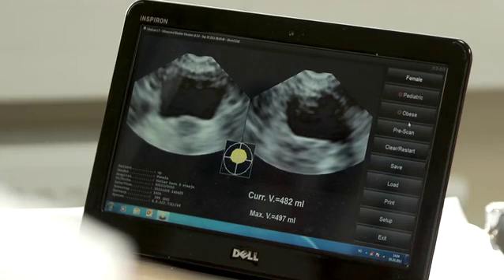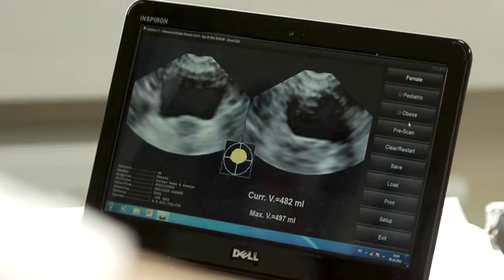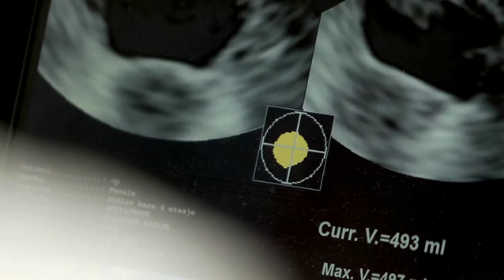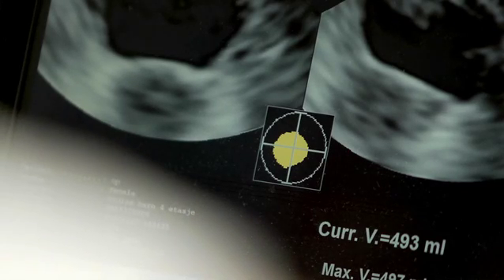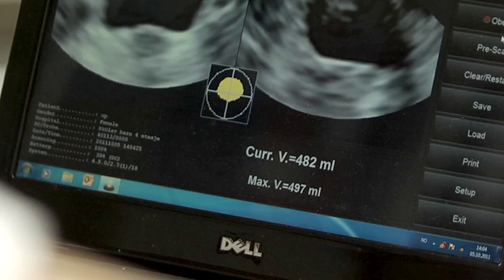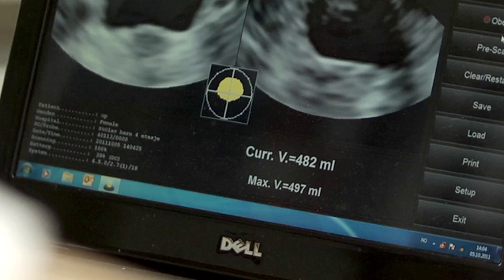Verify the scan and the yellow image showing the position of the bladder. The yellow image of the bladder should be in the center of the Thread Cross. Curr.v means Current Volume and Max.v means Maximum Volume. They may be different if several scans are made for the same patient.